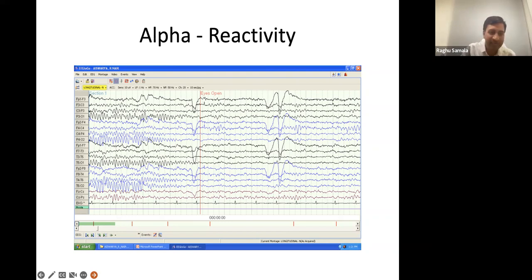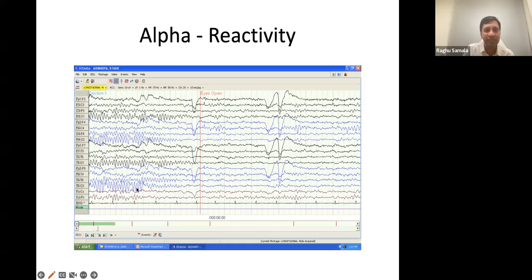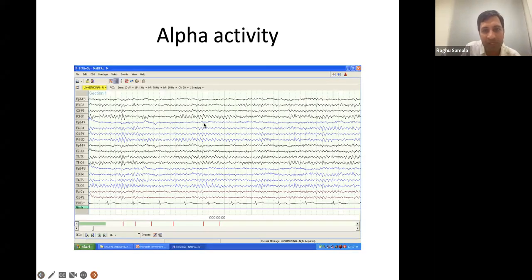So in the slides I showed, if you go back and see, now count the number of waves in the first wave. If I take 1 second, maybe first, second, third, fourth, fifth second, the number of waves is 1, 2, 3, 4, 5, 6, 7, 8, 9, 10.